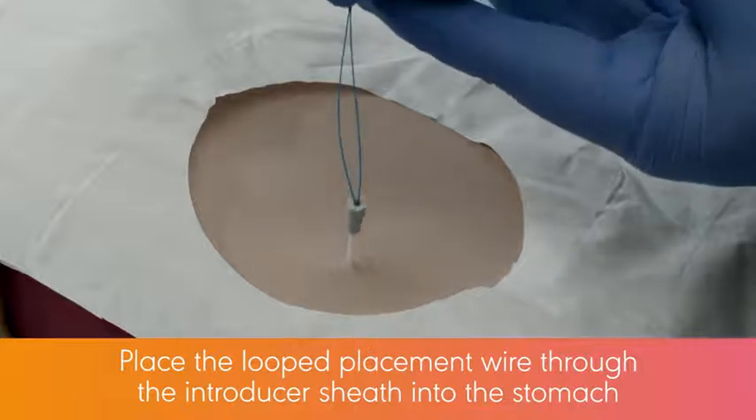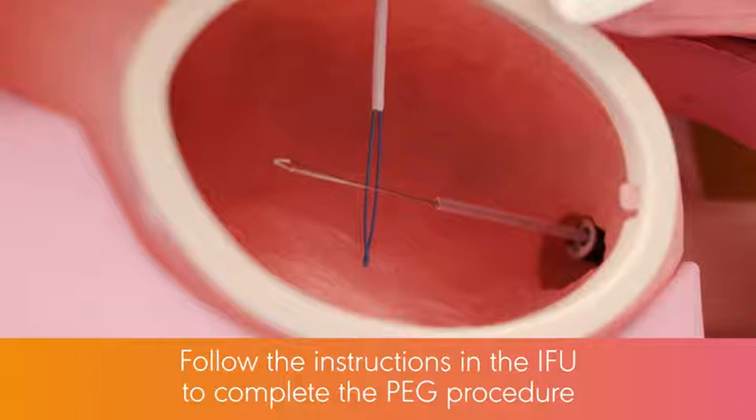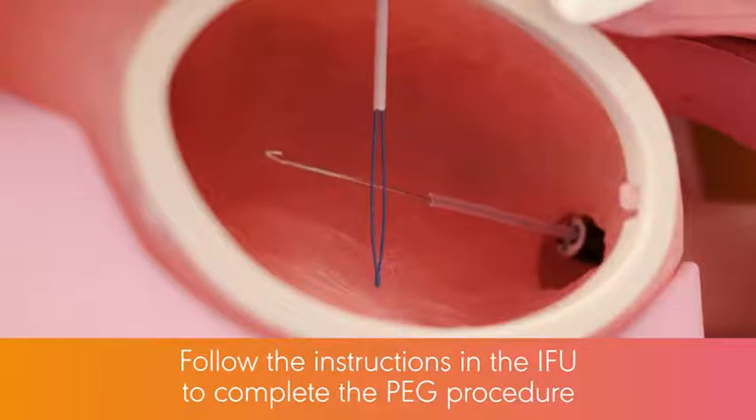Place the looped placement wire through the Introducer sheath into the stomach and follow the instructions in the IFU to complete the PEG procedure.